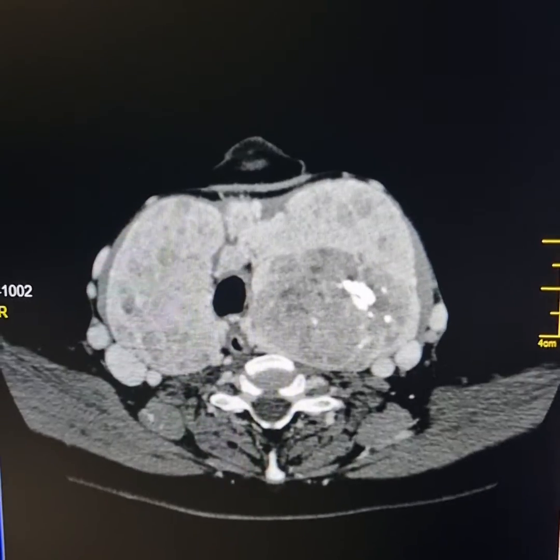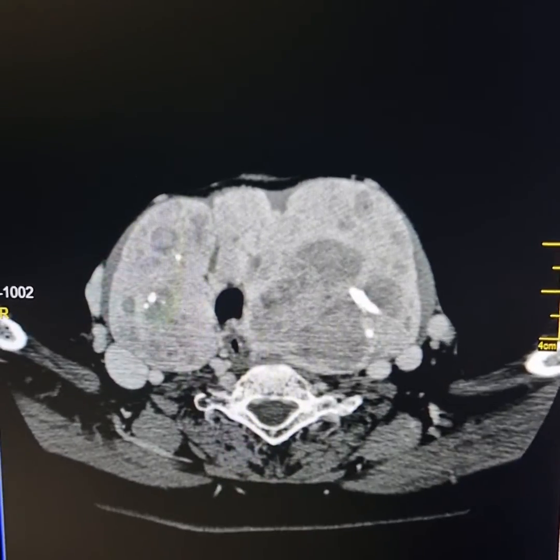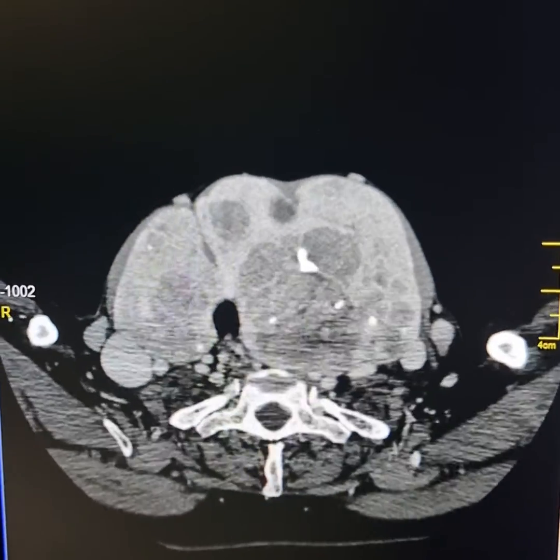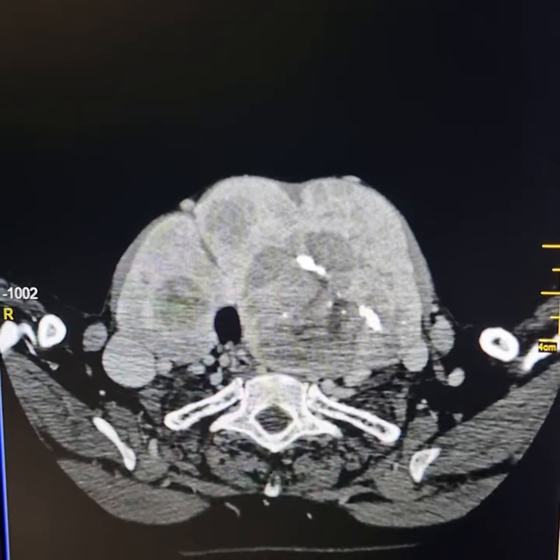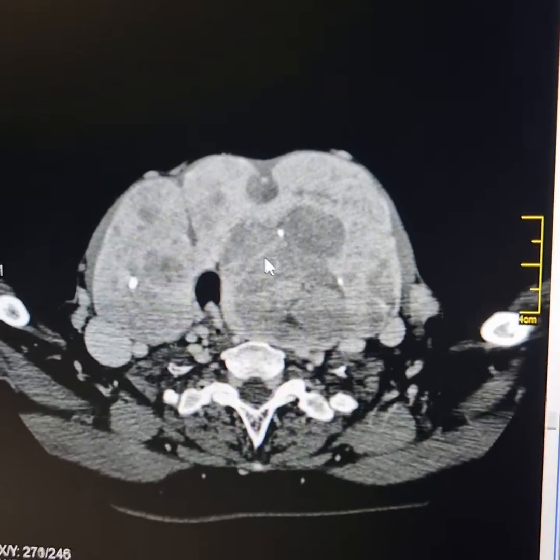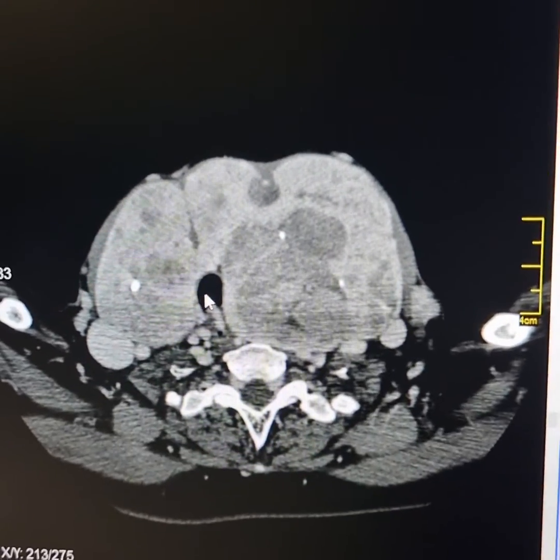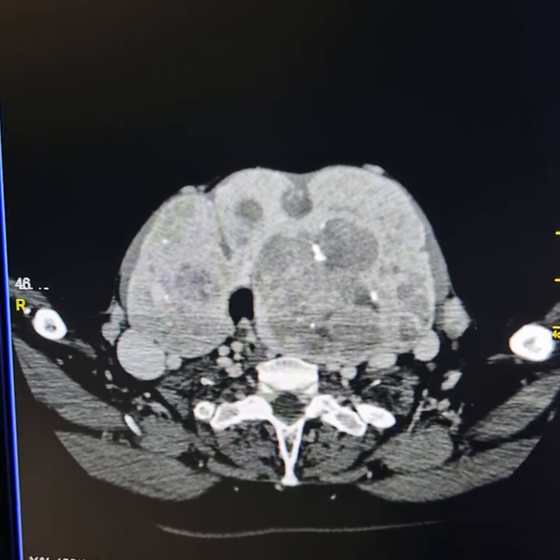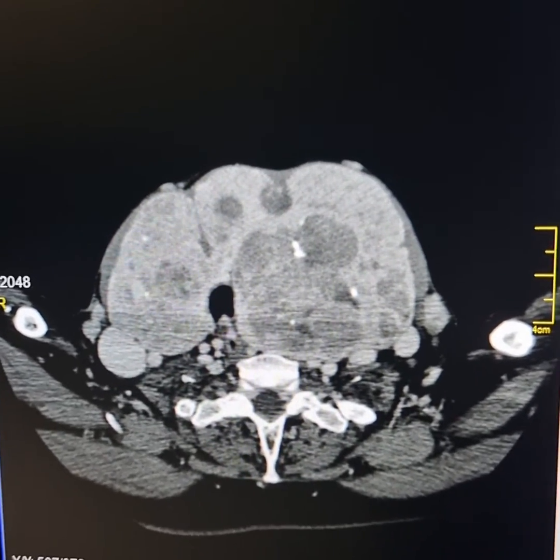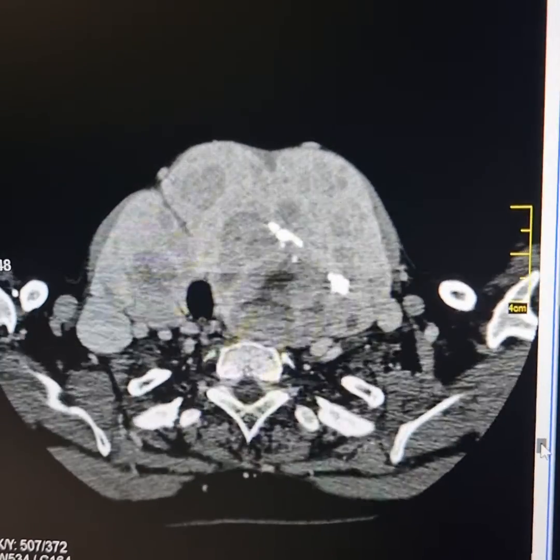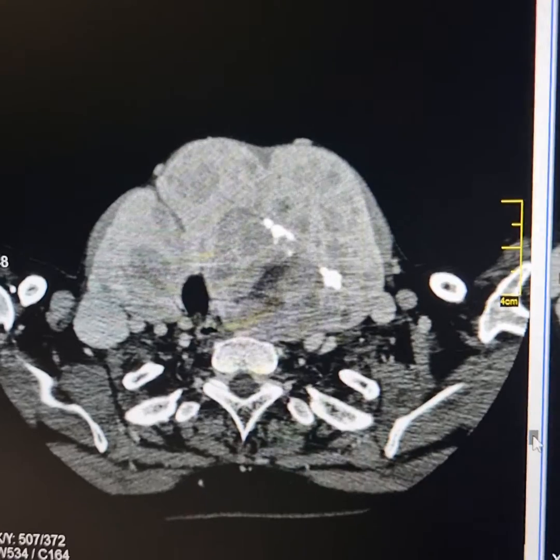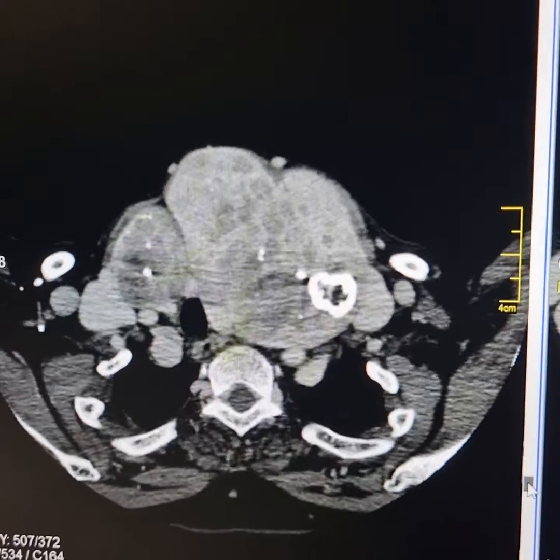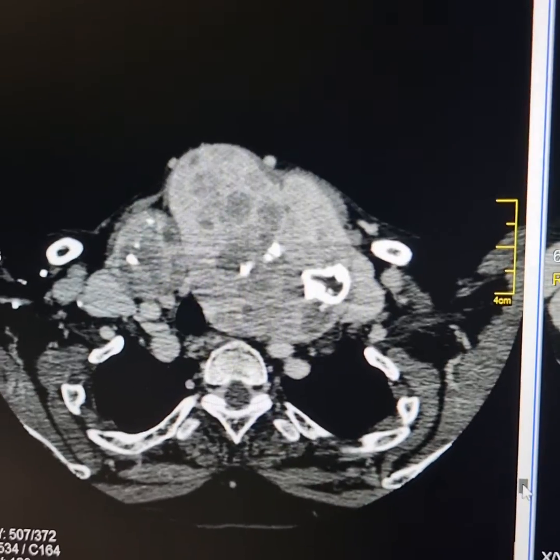Although the size of both lobes of the thyroid is huge, there is no significant narrowing of the trachea. This is the trachea; this is the esophagus. Both of these are displaced to the right of midline. Enlargement of the left lobe of the thyroid is relatively more severe.